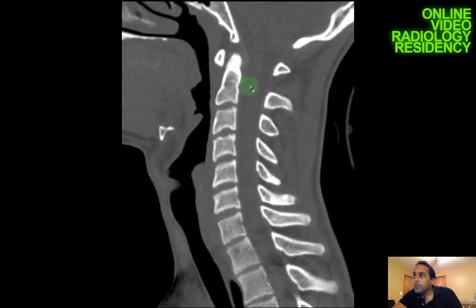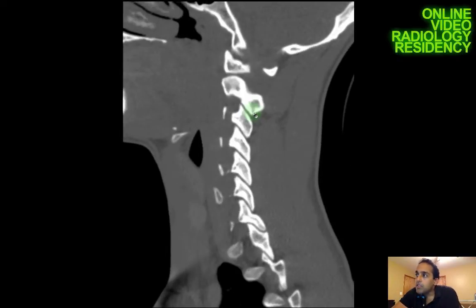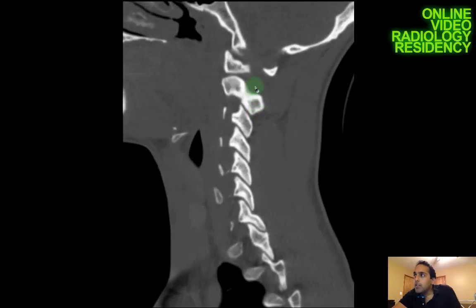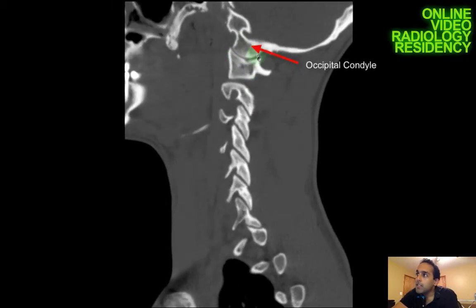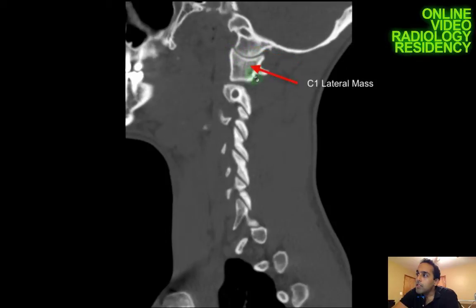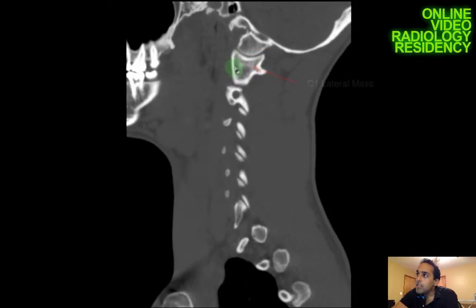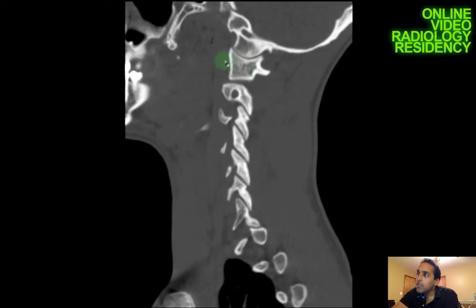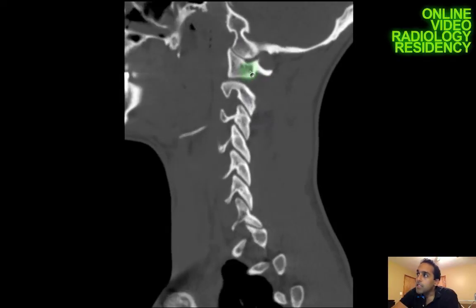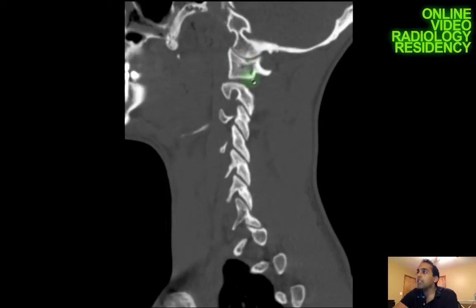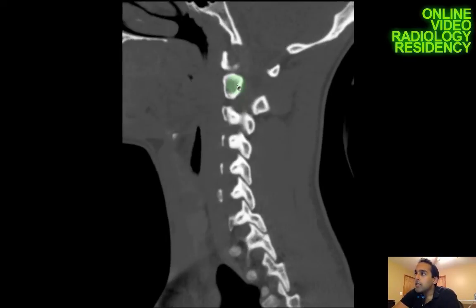Back on bone windows, once I'm done in the midline I move to the parasagittal plane. I'm looking at the occipital condyle and C1 articulation — this should be a very tight articulation. You can get a very severe, almost decapitation-type injury if these are disarticulated, so I want to make sure that's intact.